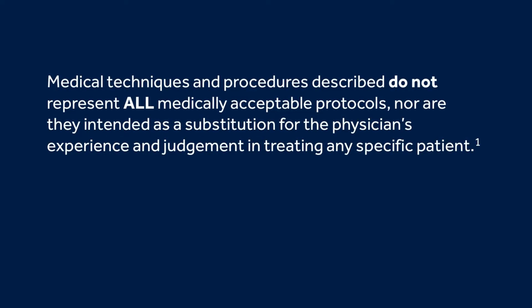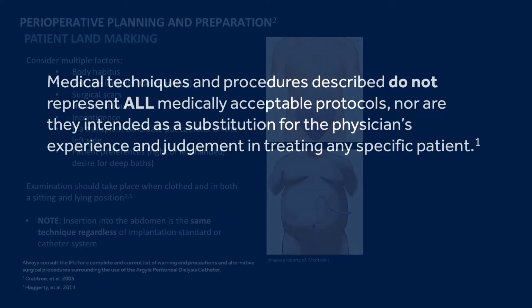Medical techniques and procedures described do not represent all medically acceptable protocols, nor are they intended as a substitution for the physician's experience and judgment in treating any specific patient.